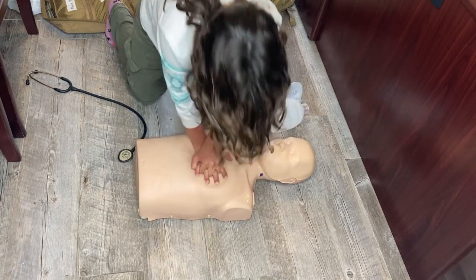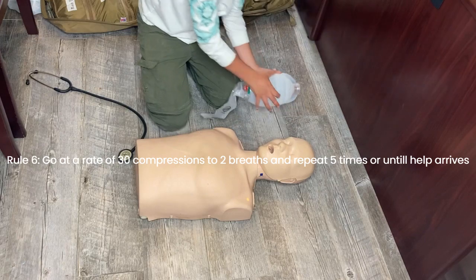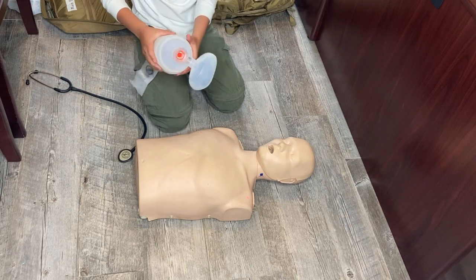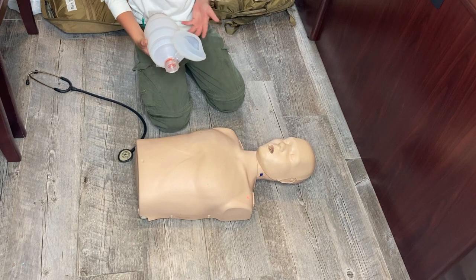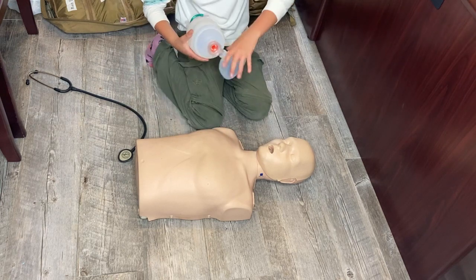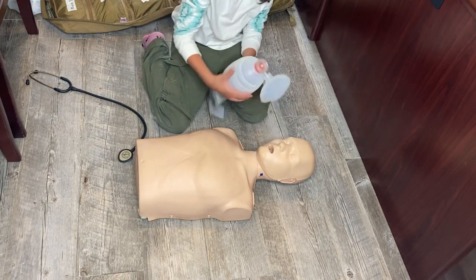So the rate is 30 compressions to every 2 breaths. For the breaths, we will use a BVM, which stands for bag valve mask. And we do 2 breaths to every 30 compressions, because doing mouth-to-mouth breathing can transfer diseases and bacteria, and it's just not safe. If you don't have one of these, I would recommend a CPR shield. And I am CPR certified, and this is not a certification class whatsoever.